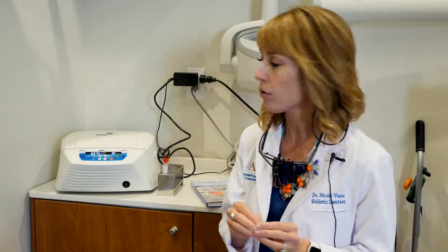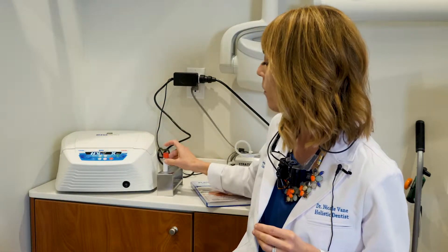What is so different about it is that the key to getting really great results is having someone where your blood starts being spun — it's very specific how and how long your blood is handled and to which vials it goes in. You really want a doctor who knows what they're doing. We draw the blood, put it in the vial, and then put it in our horizontal centrifuge. The key is that it's done within 60 seconds, so I get the maximum factors that are stimulating for healing.